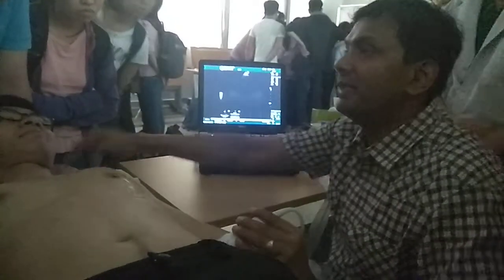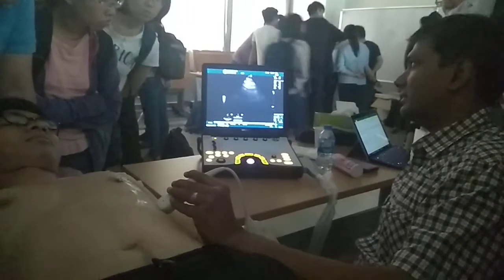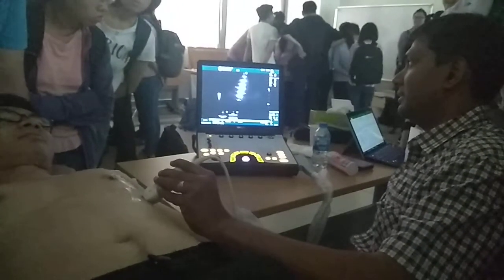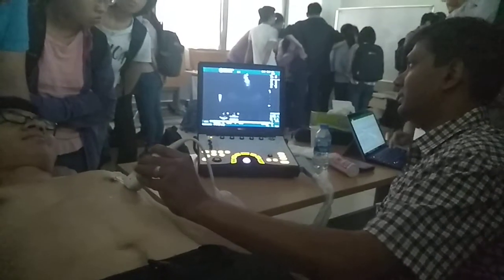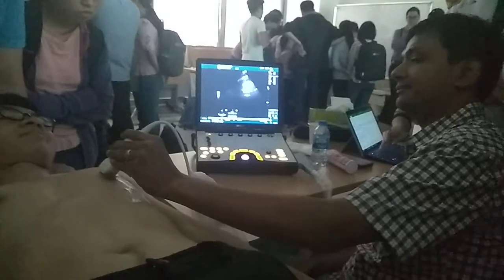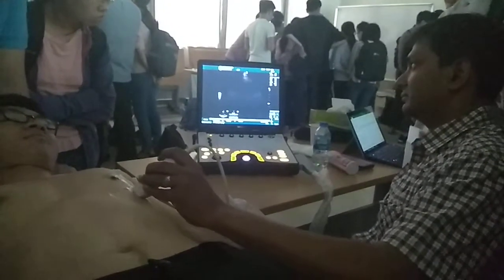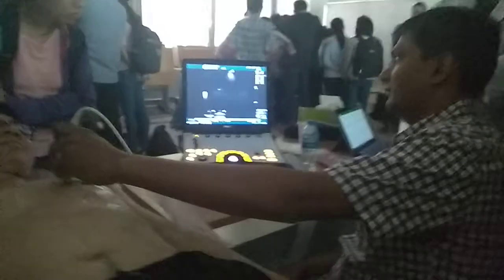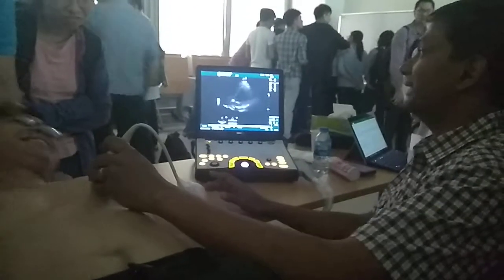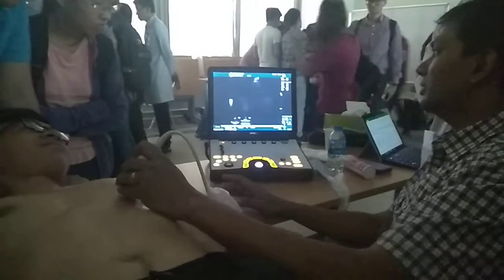Then now I'm going to go more medially, now towards the nipple. Lung. No heart. So now I'm going to go more medially. So he doesn't have a heart. There. So now what should I do?